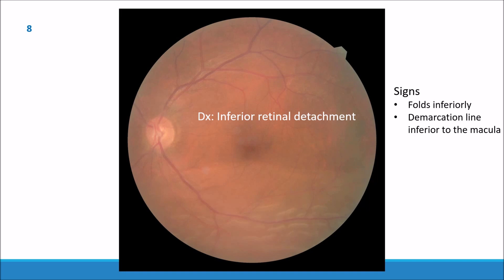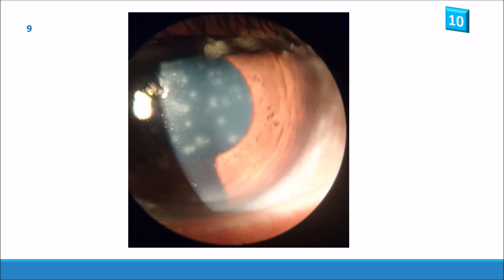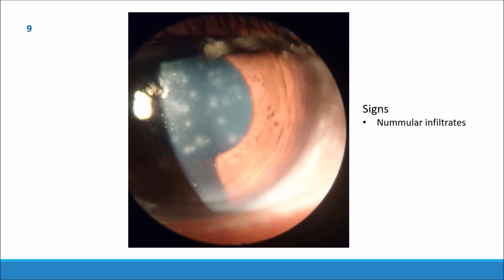Second to last slide. So there are multiple opacities scattered around the cornea called nummular infiltrates. Nummular by definition means round or resembling a coin. These nummular infiltrates make this a textbook viral keratoconjunctivitis.